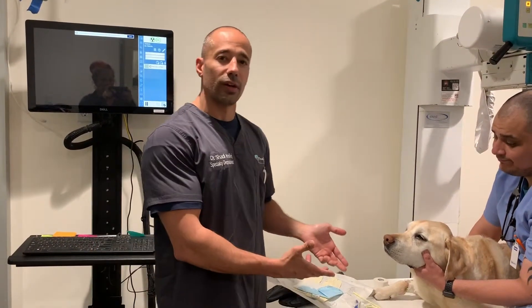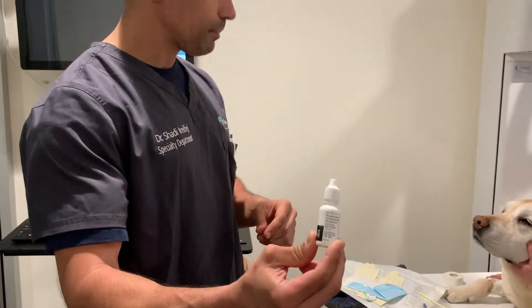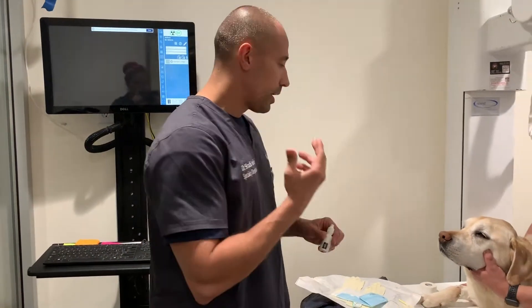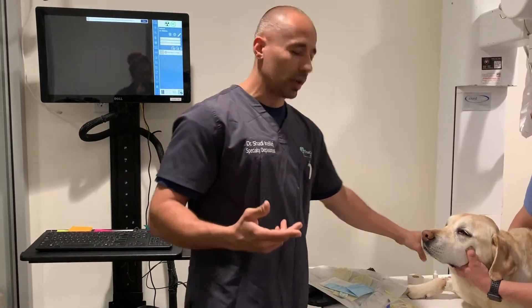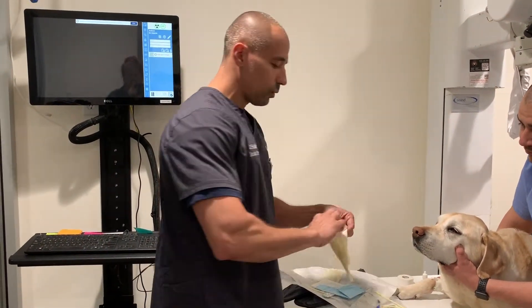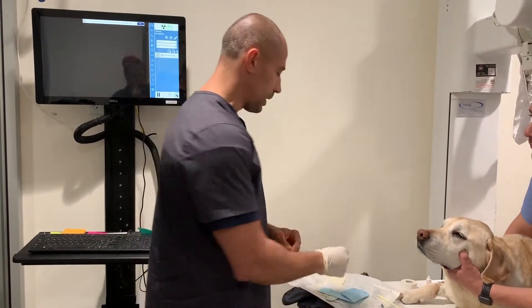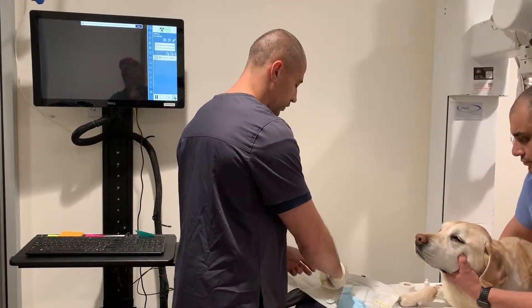Even if they're not docile, you give them a little bit of sedation and they're very calm. So Jackson here is going to receive some drugs to make him a little sleepy. We've already, ahead of time, placed some paracaine — a local anesthetic — into the nose, trying to help numb the area. That takes about 15 or 20 minutes to start working. Once you've done that, some basic instruments you'll need will be gloves. It's not really a sterile procedure, although it doesn't hurt to be a little cautious.